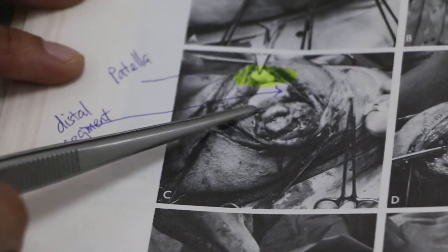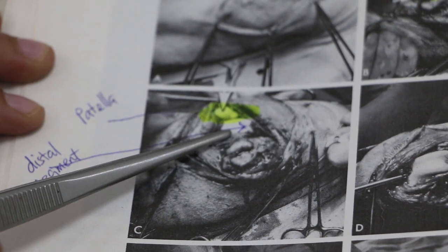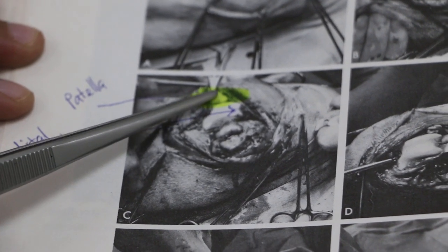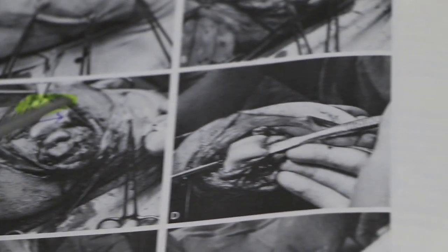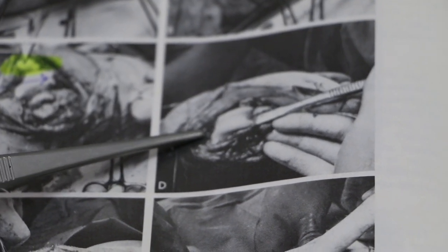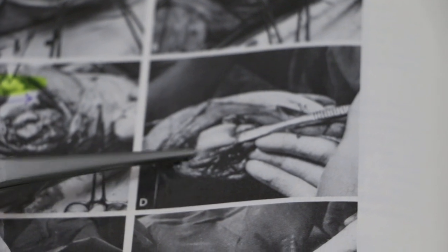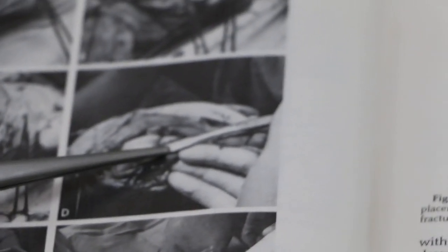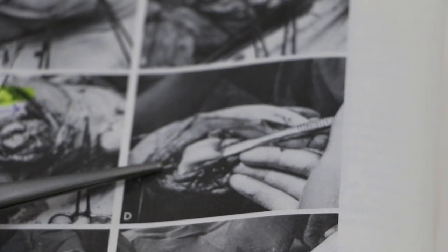Then in the third photo, we also see the distal segment here, and this is the patella — get the landmarks correct. Then in the fourth picture, we insert the pin from between the two condyles. You can do it that way, or over-reduce and come from the other side via the proximal segment.